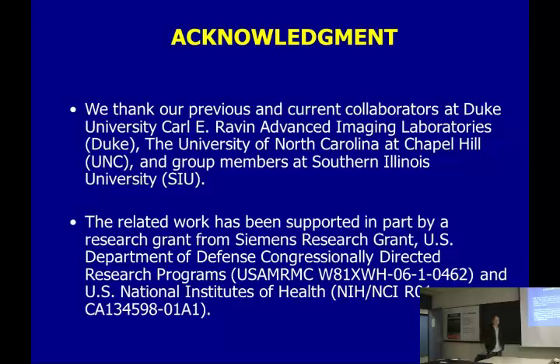Typically, you have publications, right? Because it's kind of a trend, like history. Tomosynthesis is a new technology, because you can imagine we need a fast speed detector. It's like a camera, you need to take these pictures very quickly, right? Take multiple. With CT, you can take it all around, the patient lays there. But for tomosynthesis, the patient just stays there, finishes and goes. So you need a fast detector.